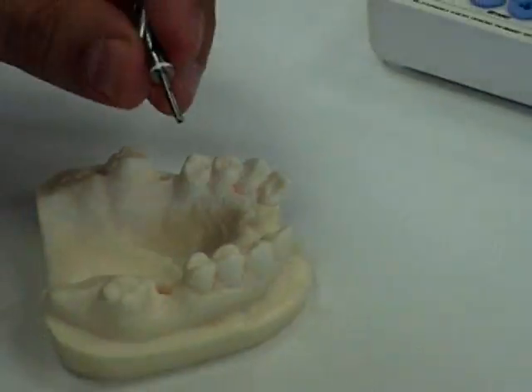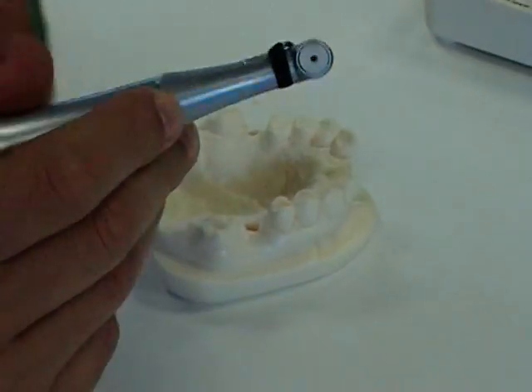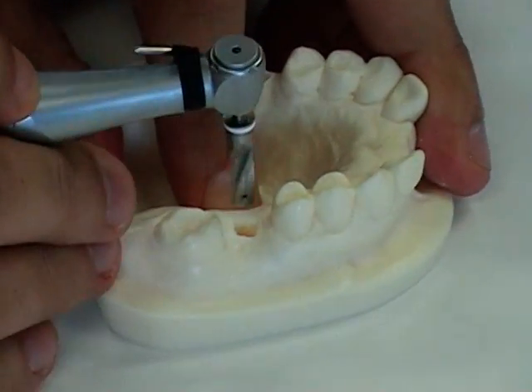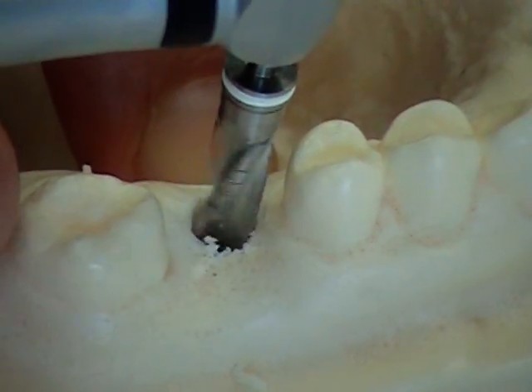The next drill will be the 5.0mm twist drill, which is color-coded white.